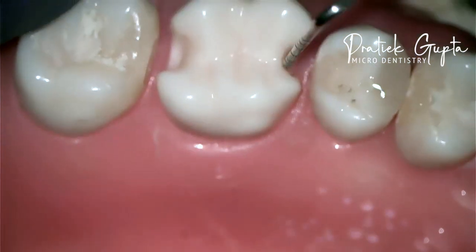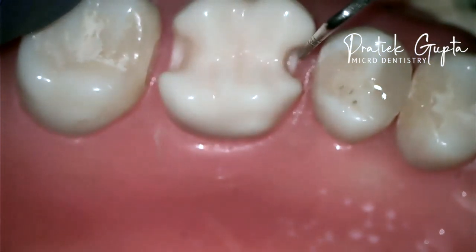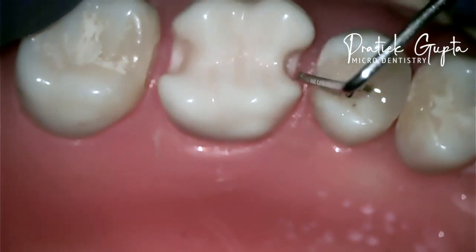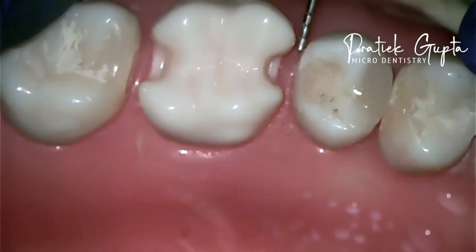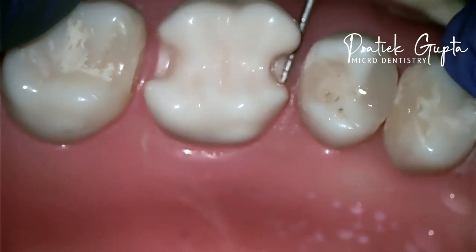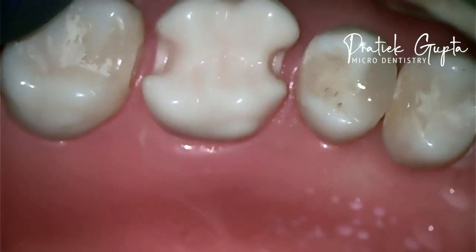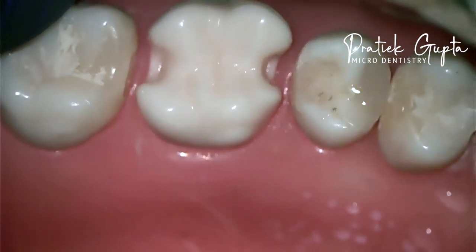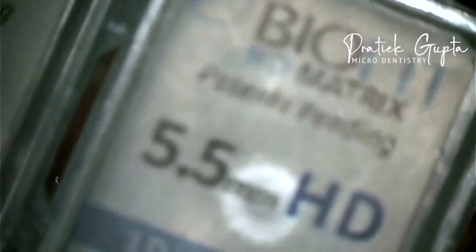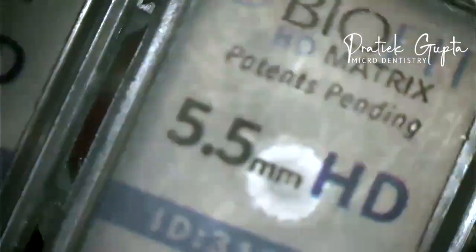So if it's 5 millimeters to the depth of the cavity prep, the BioClear matrix is designed such that it goes at least 0.5 millimeters into the gingiva. So you have to select a matrix which is 0.5 millimeters more. In this case, I will select a 5.5 HD matrix because that would best suit the situation.